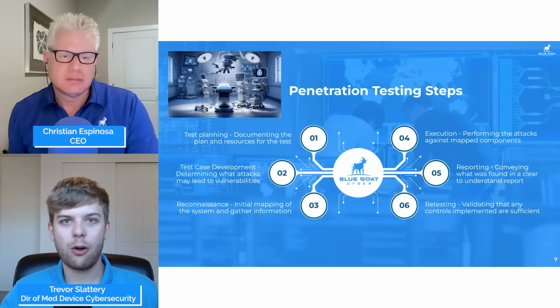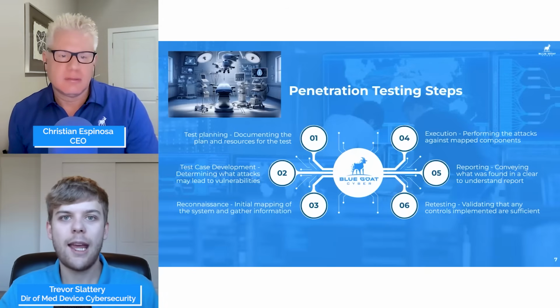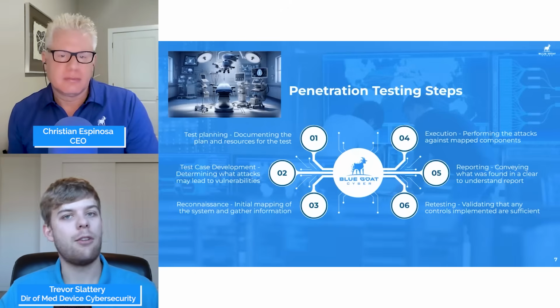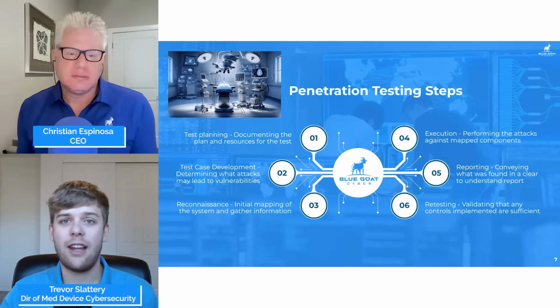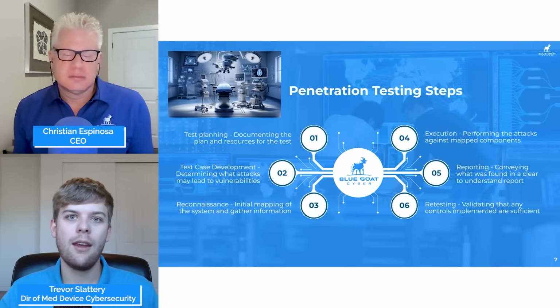So, before performing the actual exploits, we want to gather as much information as we can about the device. Under the medical device context, this is often going to be a white box approach. And what that means is that we're provisioned a lot of information, the source code with the device, lots of documentation around it. So we're gathering in all of this information to understand the device as much as we can and have some more targeted testing.